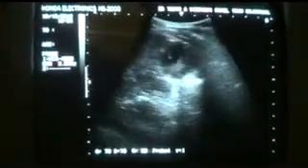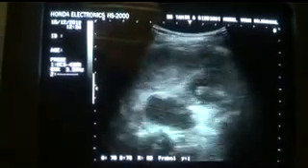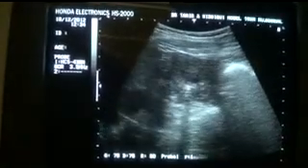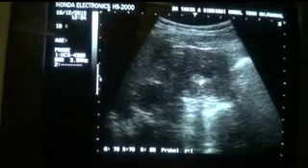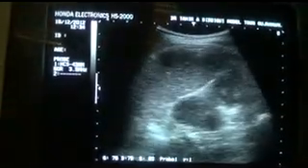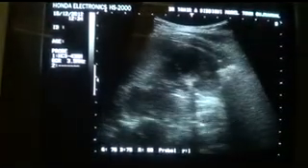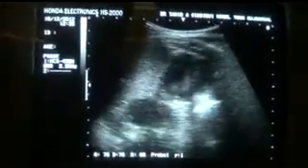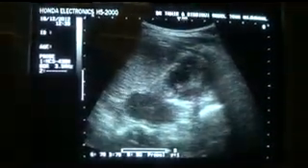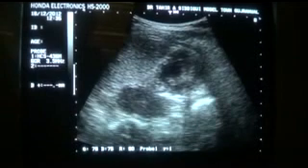Now, this is the calcification in the lower pole calyces giving posterior shadow. And here is another complicated cystic area with internal calcifications below the capsule of the left kidney, subcapsular location.